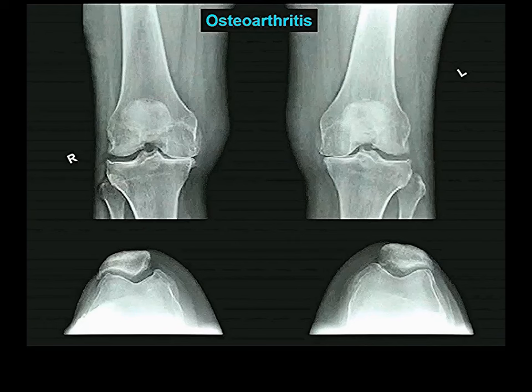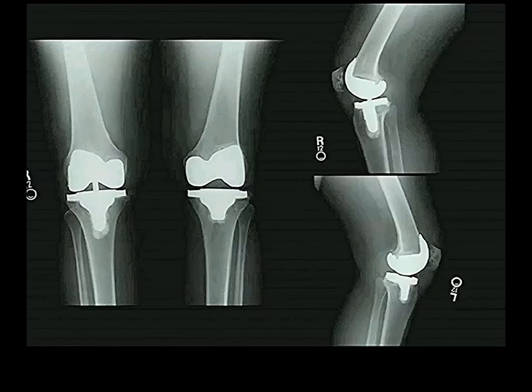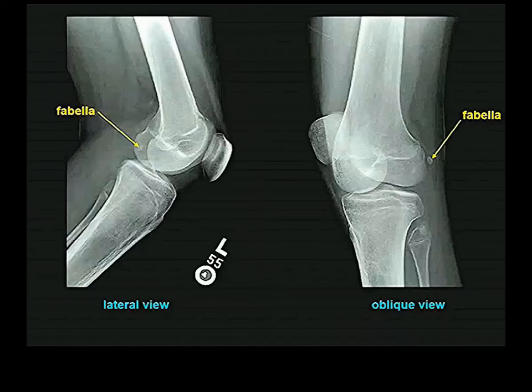Here: nice cartilage in the zone between the lateral femoral condyle and lateral tibial condyle, but no cartilage between the medial femoral and medial tibial condyles on either side. This person has bad osteoarthritis of the knees affecting the medial condyles on both sides. Treatment involves chopping off the bottom part of the femur and top part of the tibia and replacing them with metal and plastic.